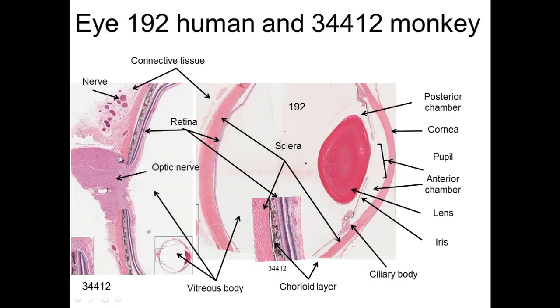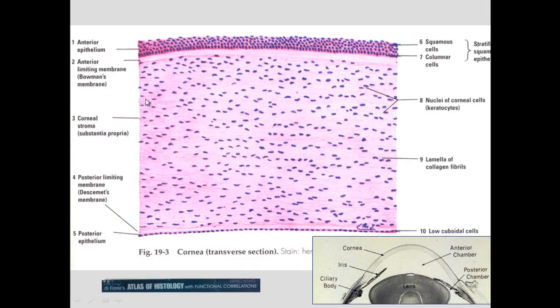If you look at the back of a monkey's eye, we see the optic nerve coming in through there, bringing blood vessels in for nourishment of the retina itself, and then the different layers of the retina, including the choroid. The dark part here is the choroid. Remember the blackened box, and also it has a rich vascular supply, some nerves out through there, but that's basically the structure that we will see.